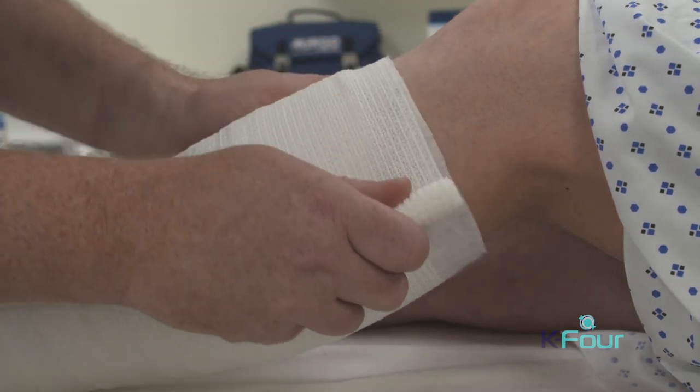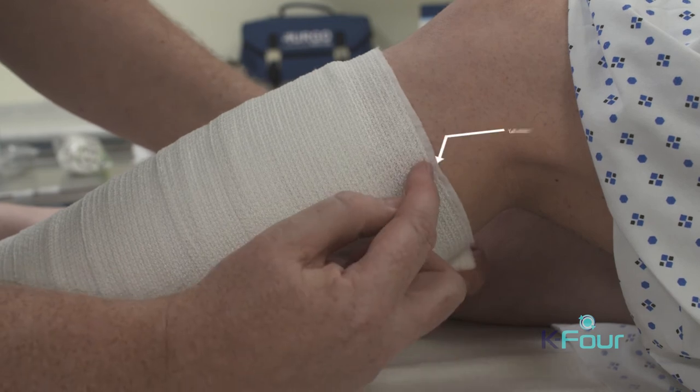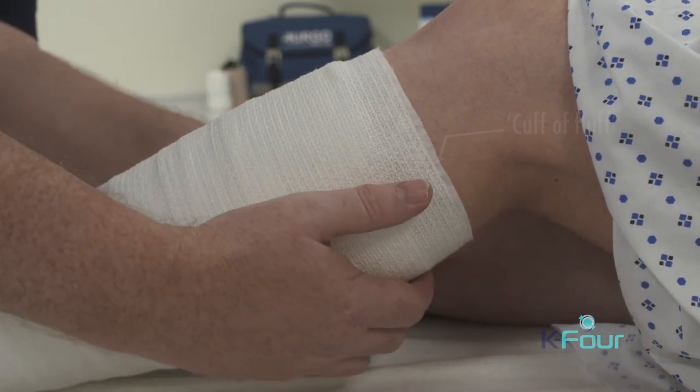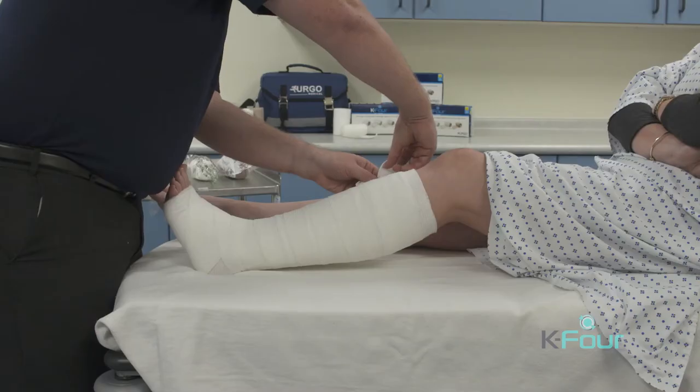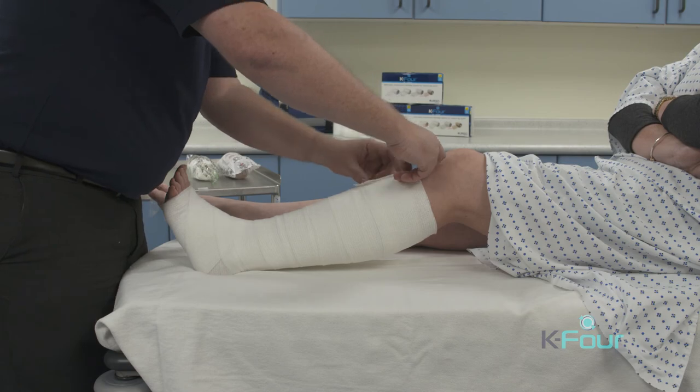When the top of the limb is reached, slacken off the bandage and a cuff of fluff should be left between the top of the bandage and the patient's skin. At this point, cut off excess bandage, as extra K-Lite layers would give added pressure.